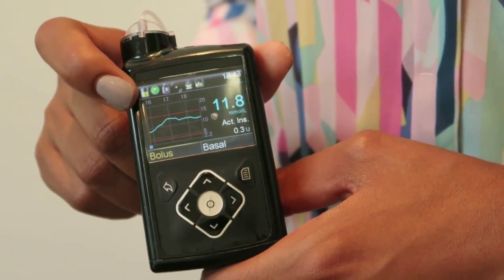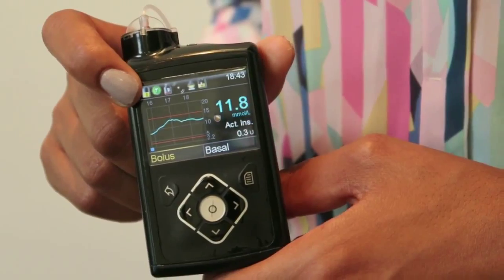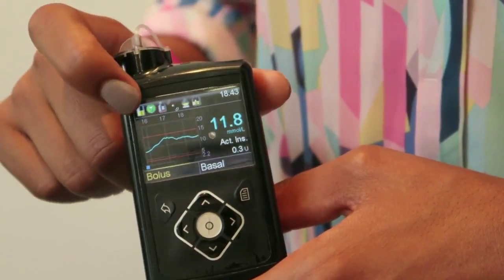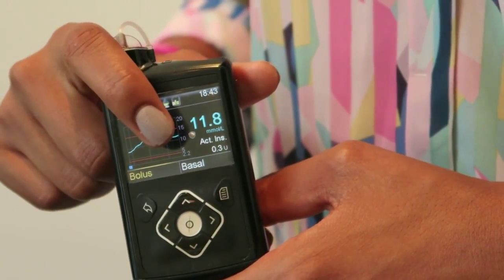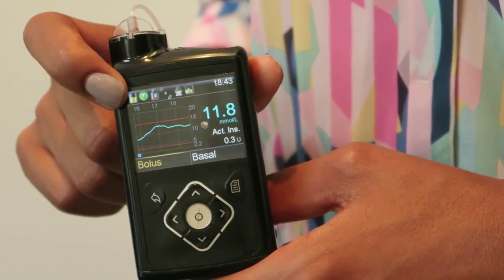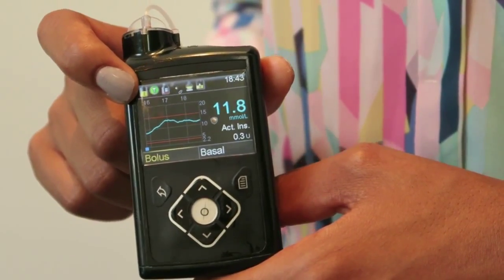We've also got a graph of what the sensor tells me that my glucose levels are doing at the moment, which is really handy to see. You've also got the current reading that the sensor is giving. Quite often, arrows appear where the glucose level is, so they tell you which direction your glucose levels are moving in and at what speed, which is really helpful.